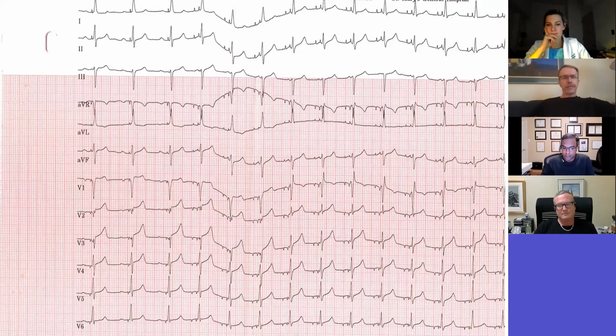Sorry, I misunderstood. If you're capturing the septum or not, I agree, is not relevant. The problem is when you only get a narrower QRS with the higher output, that maybe with a lower output, you lose conduction system capture altogether and you have only septal pacing. And that's something that in the clinic can easily be missed if an ECG is not being done.